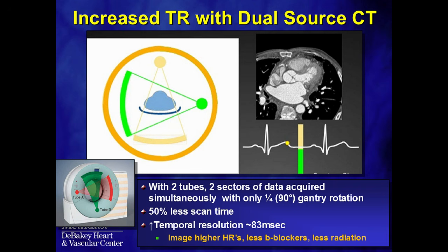Then someone thought, hey, nuclear cameras have two heads. Why can't we do the same with CT? And that is the technology we have today. Upstairs and across the street, we have two dual source CT scanners. The concept is very simple: you have another head, another X-ray source and detector located exactly orthogonal to the first one.